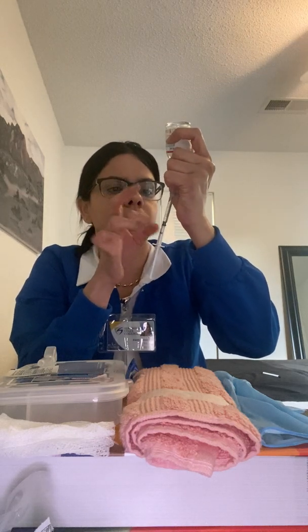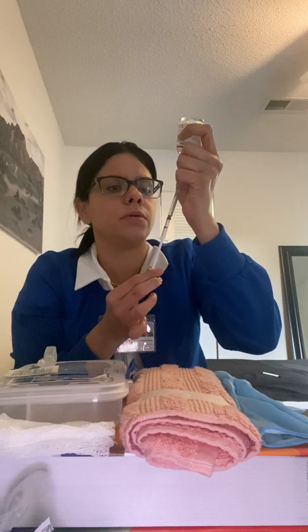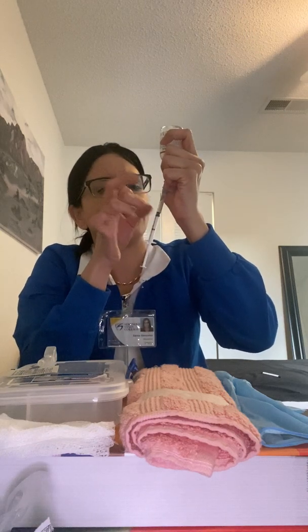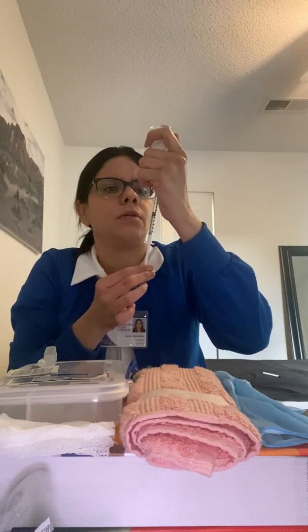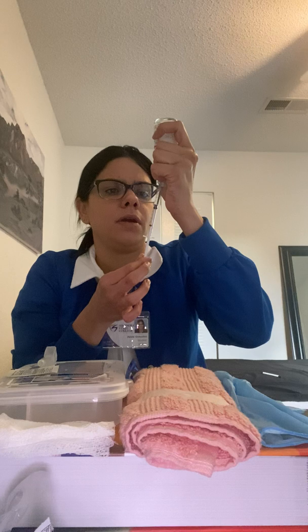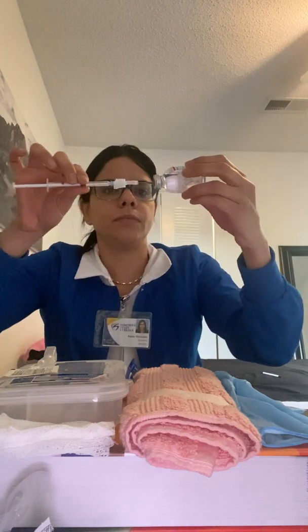Sometimes it's a little bit tricky, so I just have to tap, tap, tap until you get rid of those bubbles, because you don't want your patient to get them. Sometimes you have to go back and forth, but I think I got it, and I'm going to show you. All right, so now that I got it, I'm going to take it.